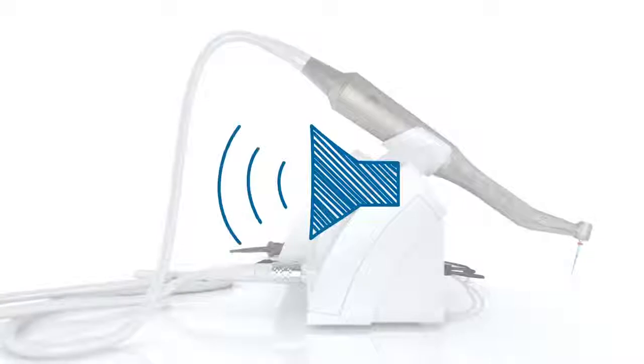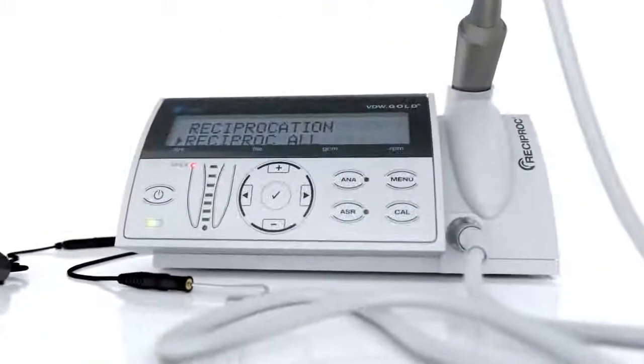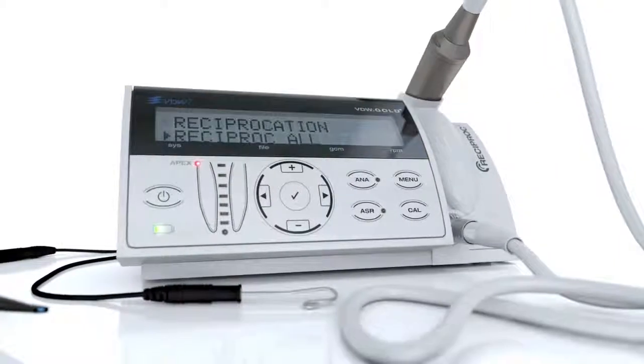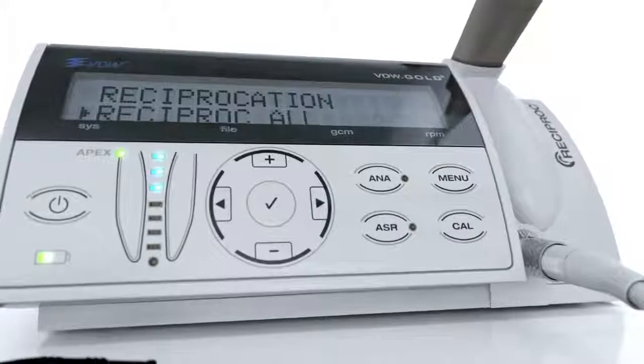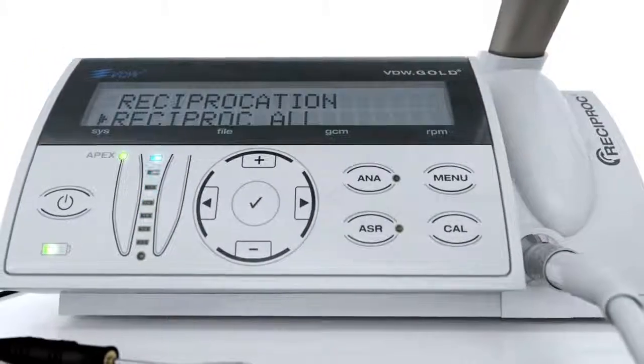The VDW Gold Reciproc comes with an integrated apex locator. The LED indicator for electronic length determination is located on the left. More details on this in a separate video.